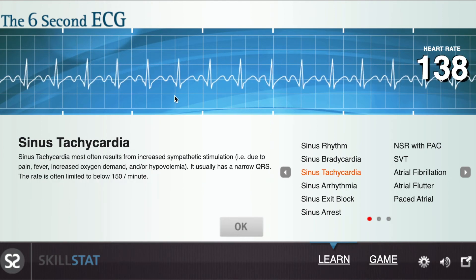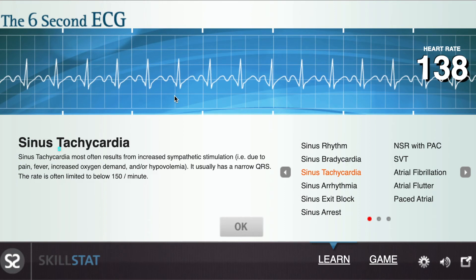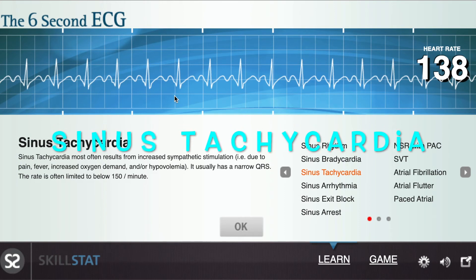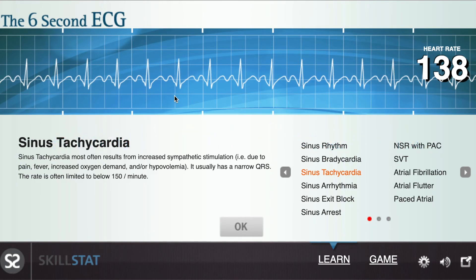In this rhythm, I count a total of 13 to 14 QRS-waves. Therefore, the heart rate is about 130 to 140 beats per minute. This is an example of sinus tachycardia, as the heart rate exceeds the normal range of 60 to 100 beats per minute.